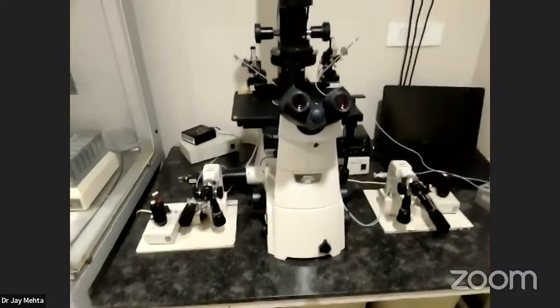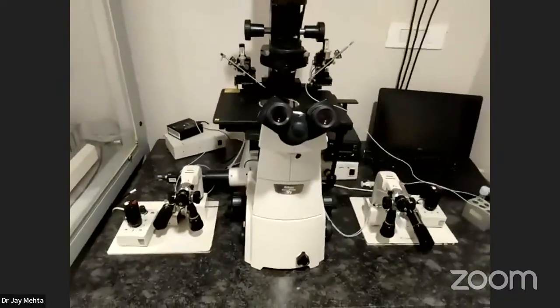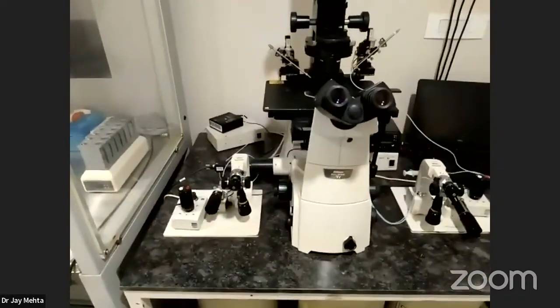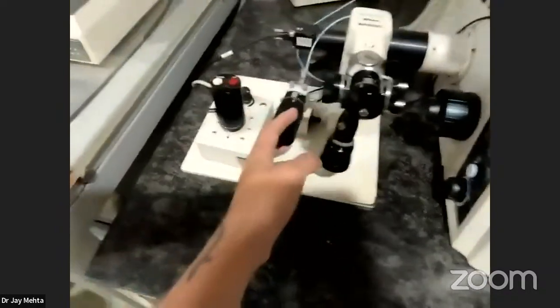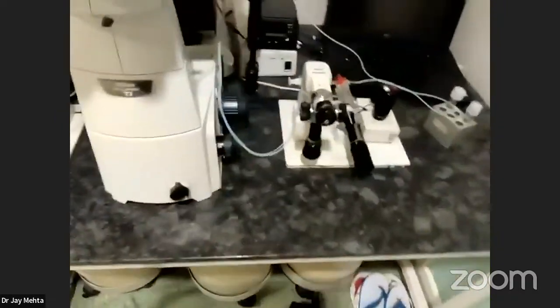Okay, and then comes your final checkpoint, which you should probably be careful about: your ICSI machine. A lot of people experience problems in ICSI machines because they don't use it on their own. One embryologist will come and just move one of the joysticks or one of the screws here and there. And then what will happen is, once the joysticks and the screws are moved, quite a lot of times, can you see this?